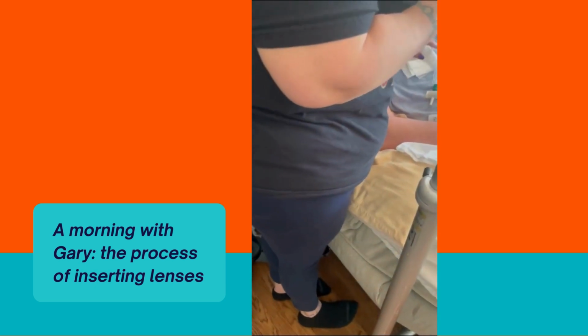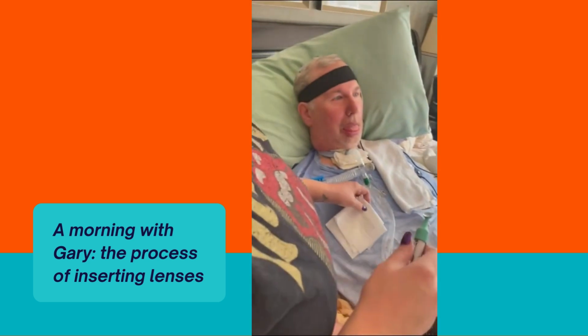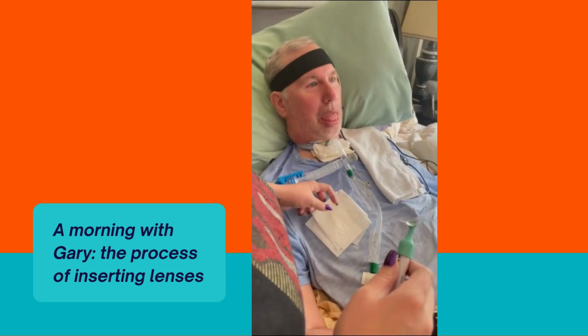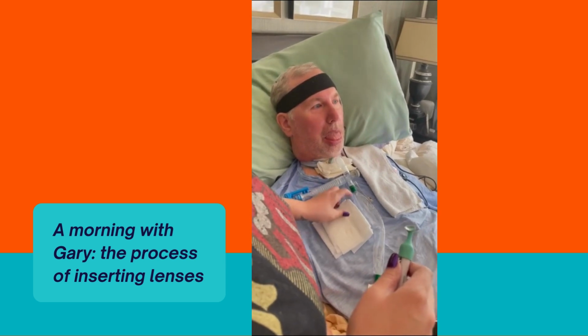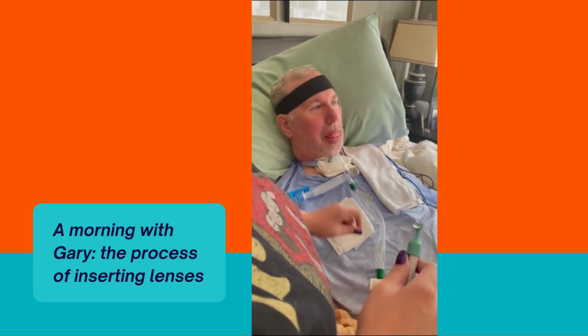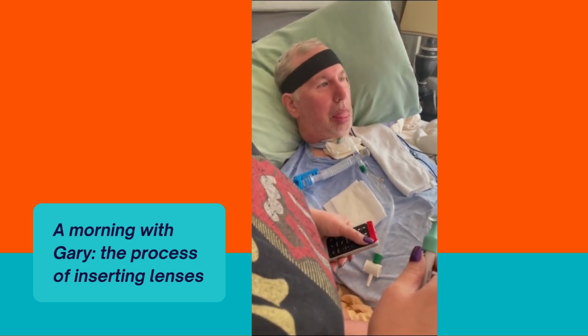Okay, so I'm going to move this out of the way, and then I'm going to come over and show what Bernadine's doing. So, awesome. Bernadine's going to work with Gary. Now, Gary happens to be in bed, but this could easily be done. We do it sometimes in his shower chair. We'll do it in his power chair. We'll do it in his regular chair, anywhere. We're just doing it this morning in bed.